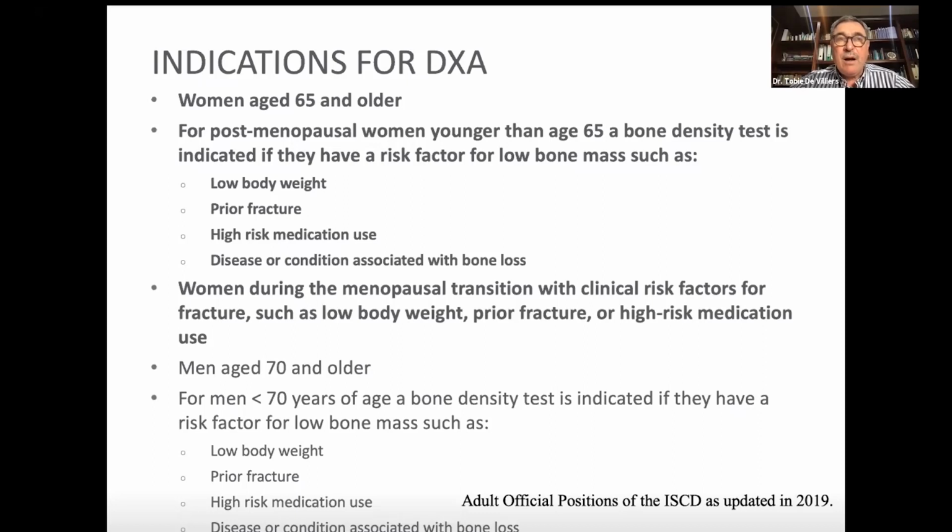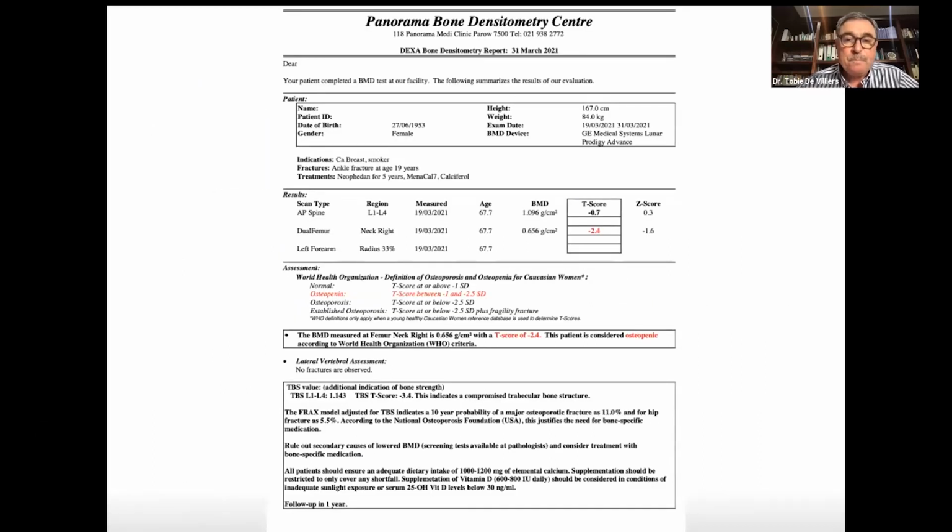And it is hardly ever necessary to do a DEXA examination in a premenopausal woman, except in very severe circumstances and mostly when fractures have occurred.